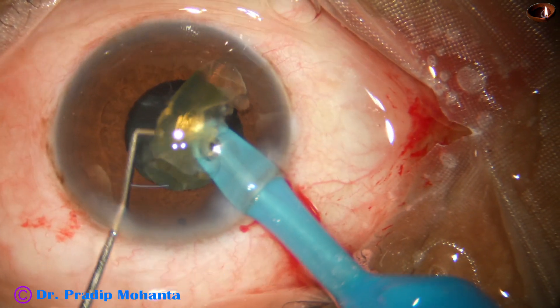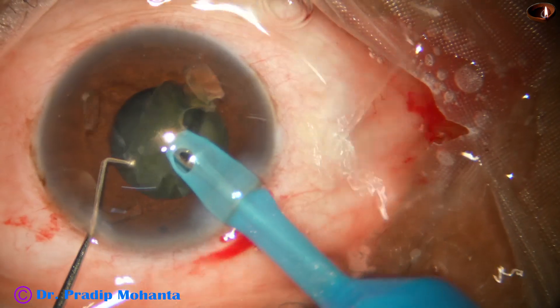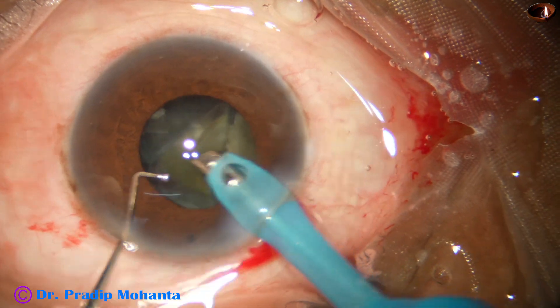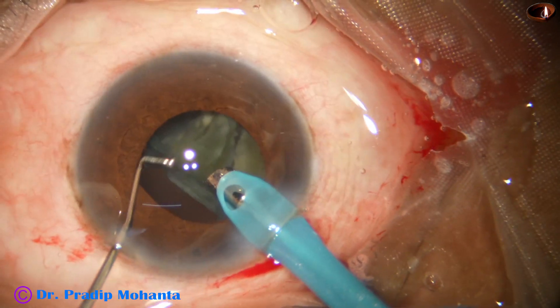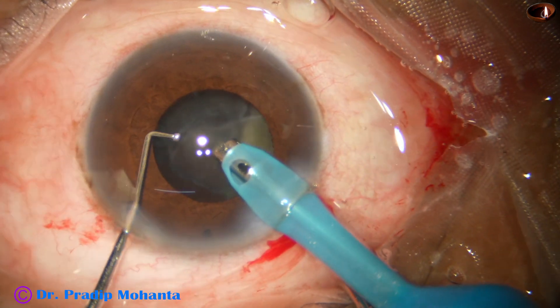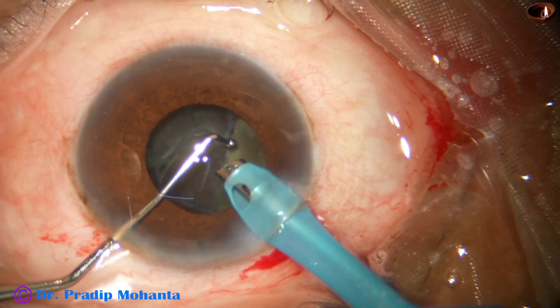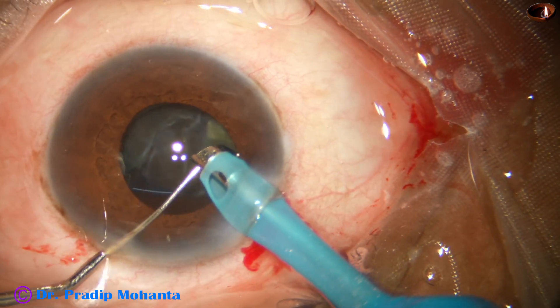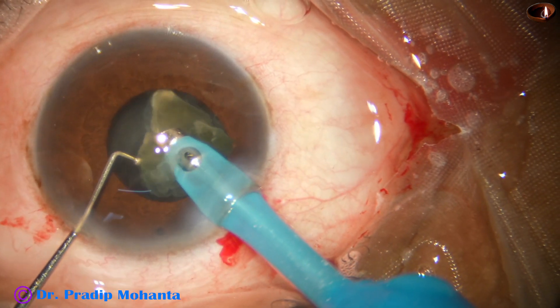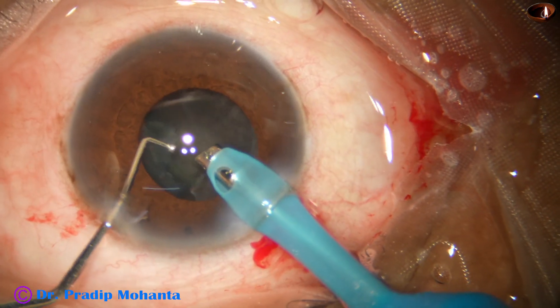The Nito chopper is the best instrument for horizontal chop. It goes along the equator safely. The ball tip is very friendly to the posterior capsule, and it is a nice instrument for soft cataracts. I have started using this recently for soft cataracts and I find it very useful.